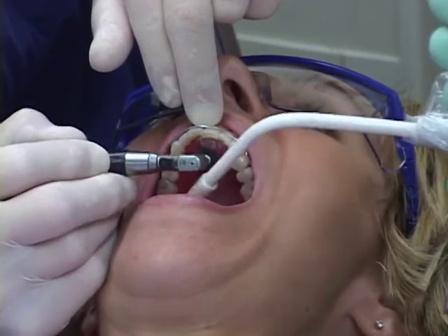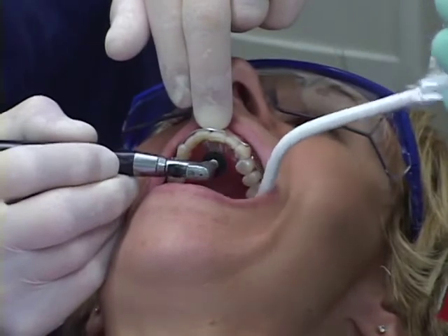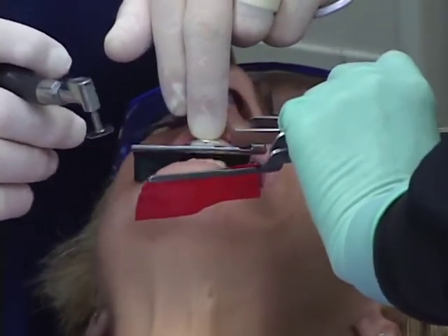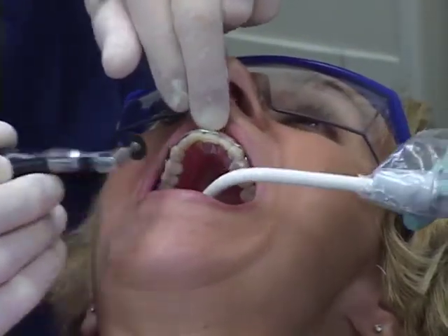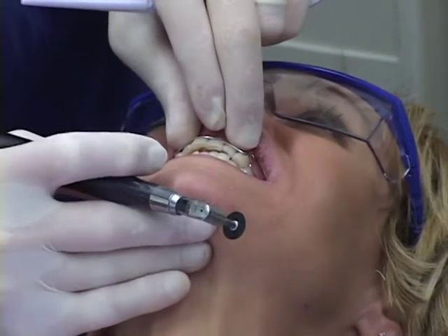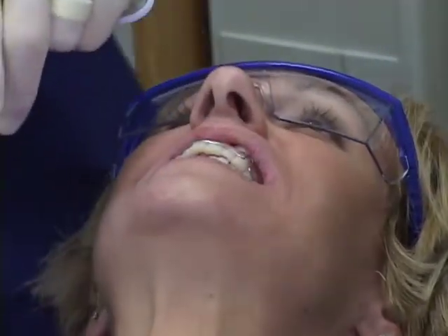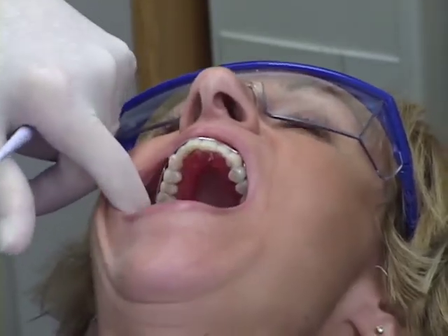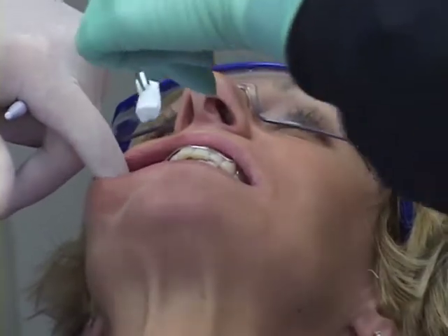Again, you can use a high speed for this also. I like using a disc that leaves again a nice flat surface. Good. Goes down. Okay. Let's go ahead here now. One more time. And then we're going to go to the right side again then.